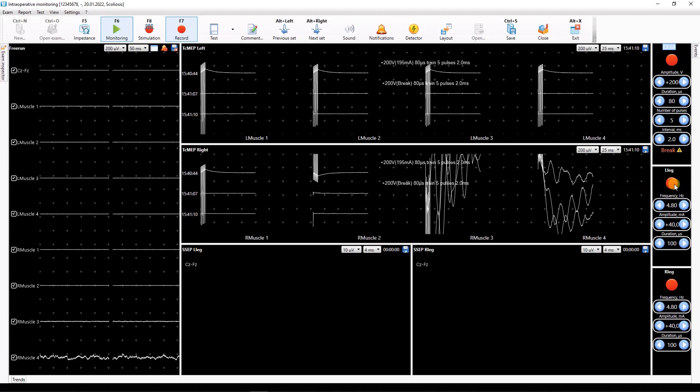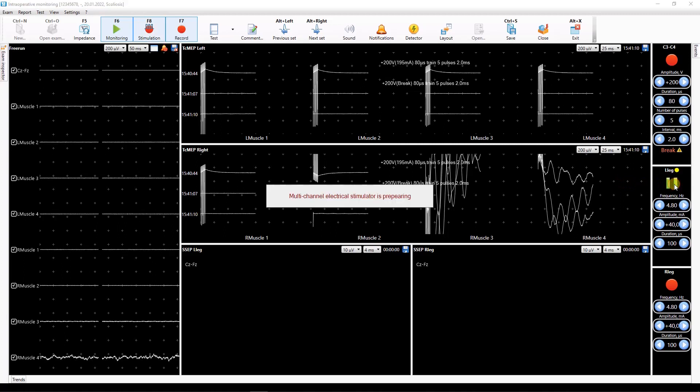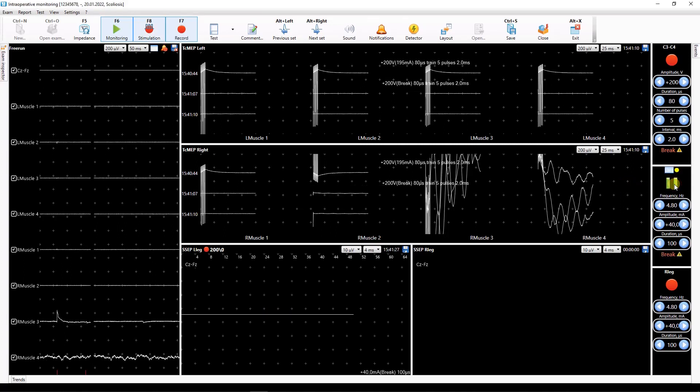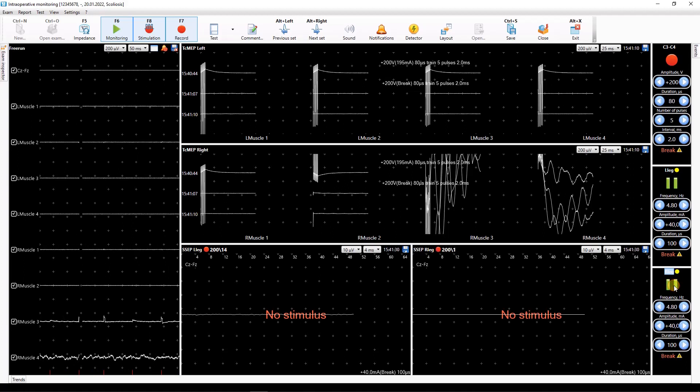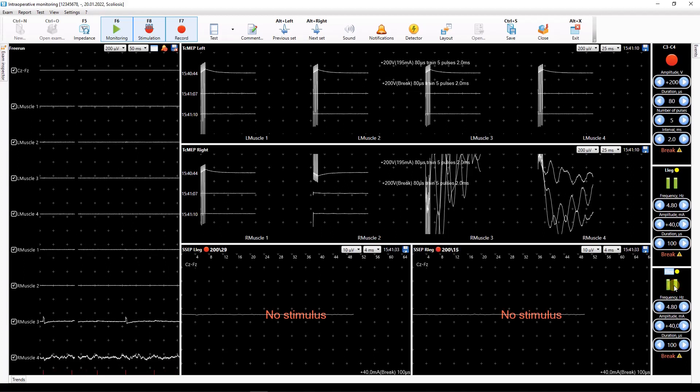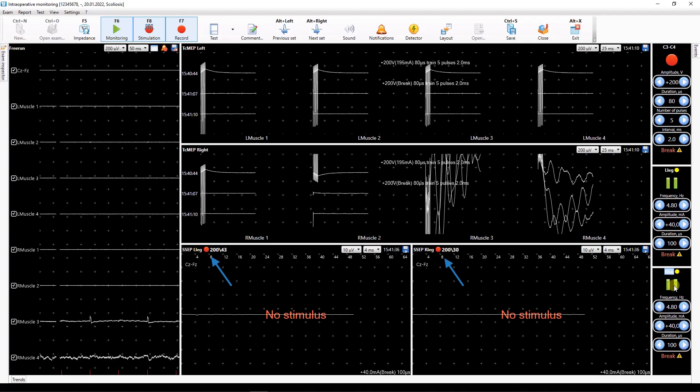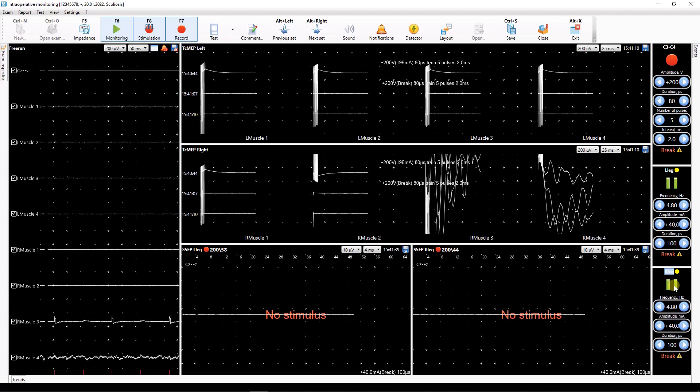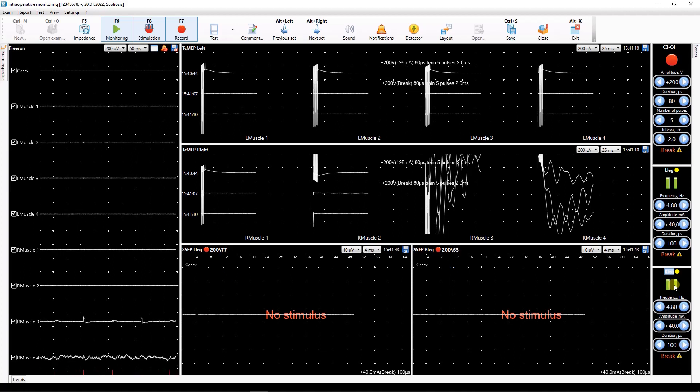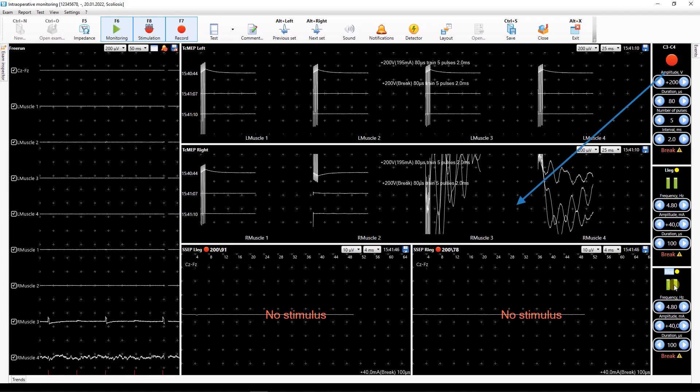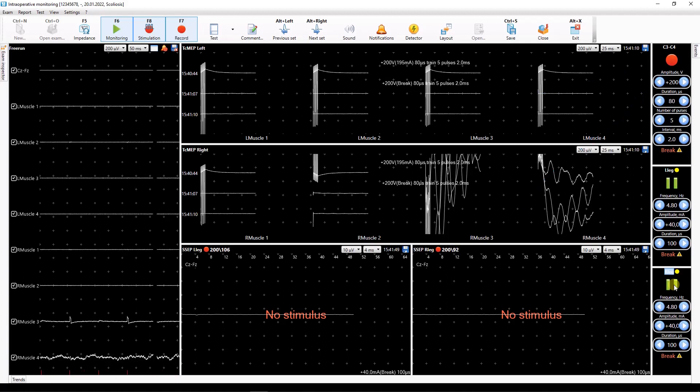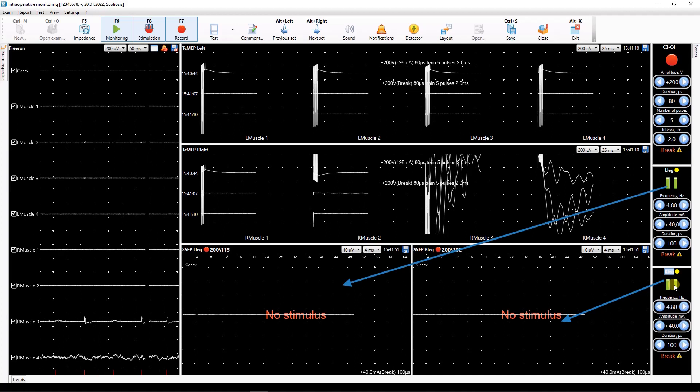In the data windows corresponding to this stimulator the recording process begins and the traces appear. A red circle lights up in the window where the signal is being recorded at the moment. Depending on the test settings one stimulator can be related to several trace windows as well as one data window can be related to several stimulators.